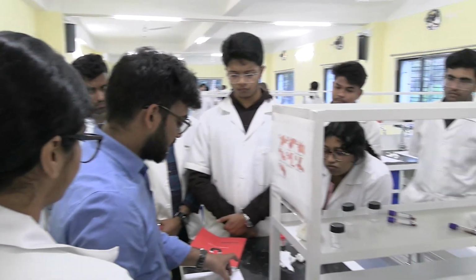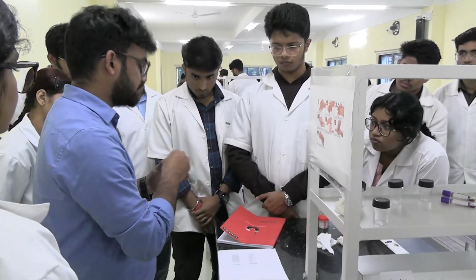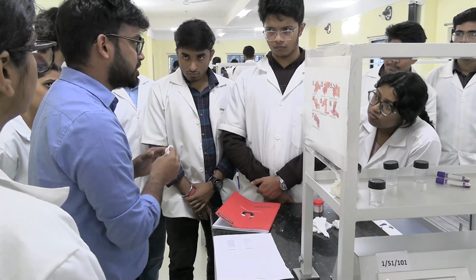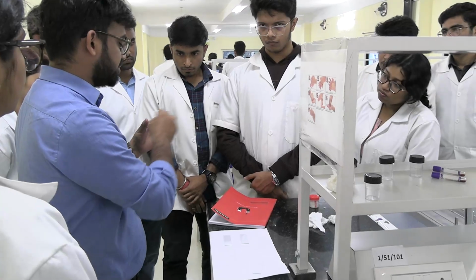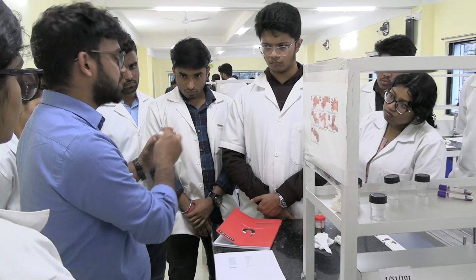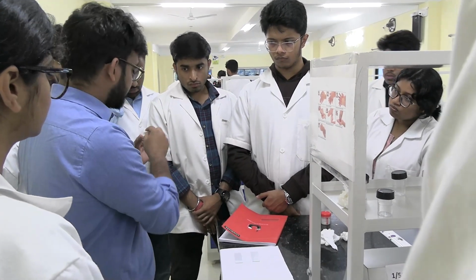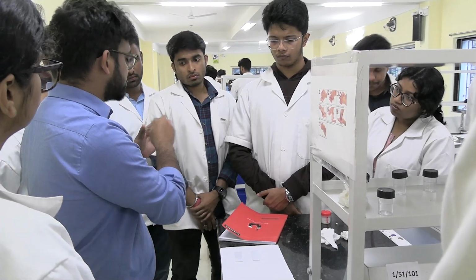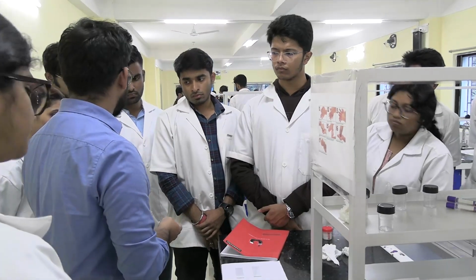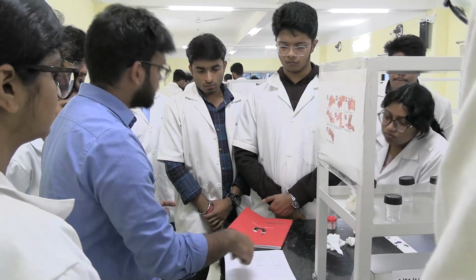Now what am I doing? I have cleaned it, just for showing you again. Practically, wash it with soap water. But here the slide is already washed, so I'm going to wipe it, to look for any presence of pieces of paper. Make sure there are no remnants of the paper on the smear surface. Suppose this is the upper end of my smear on this paper. These two smears are already clear.